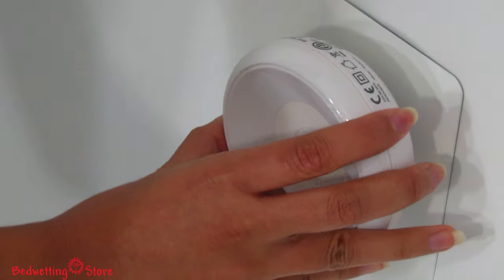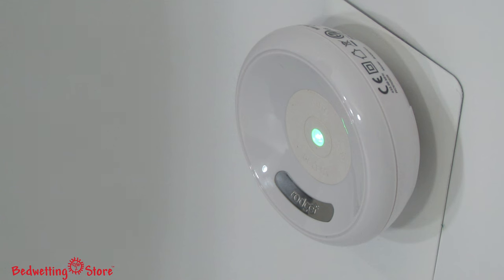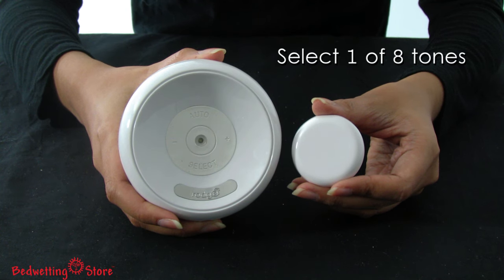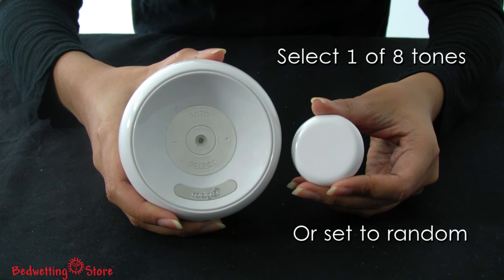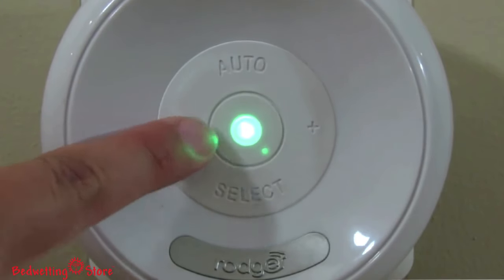To get started, plug in the receiver and press the central LED button. The alarm transmits at least 75 feet. You can select one of eight different tones or let it randomly play the different tones. To adjust the volume, press the plus and minus button repeatedly.